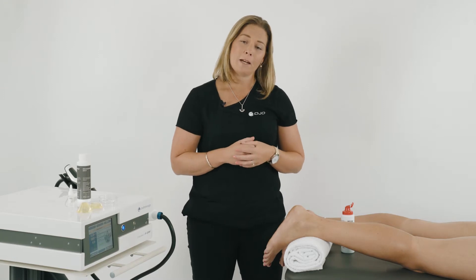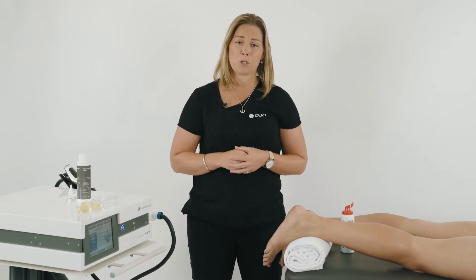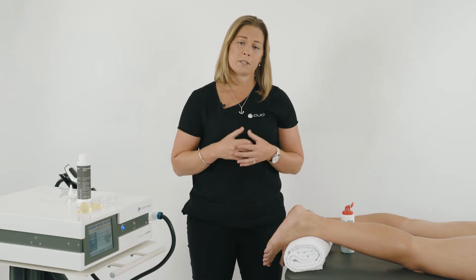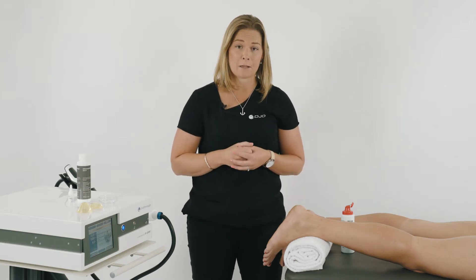For plantar fasciitis we can use radial pressure wave and focus shockwave. What focus shockwave allows us to do is to deliver more energy to greater depth. The other advantage of focus shockwave is that treatment times are often less. With focus shockwave, we'll need somewhere between one and three treatments, whereas with radial pressure wave it can be somewhere between four and six.